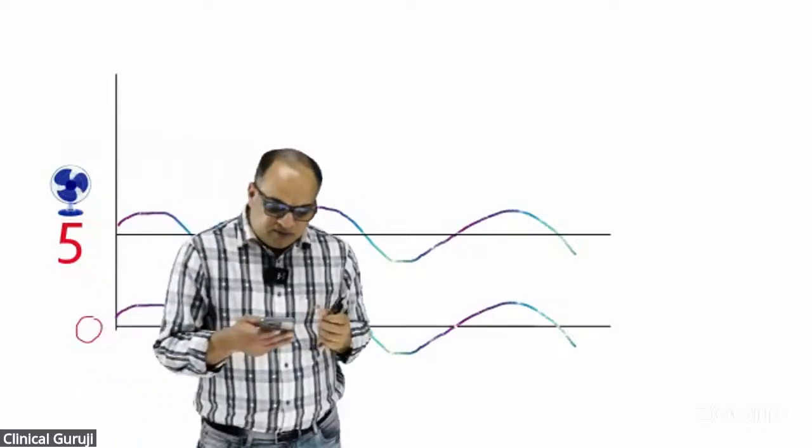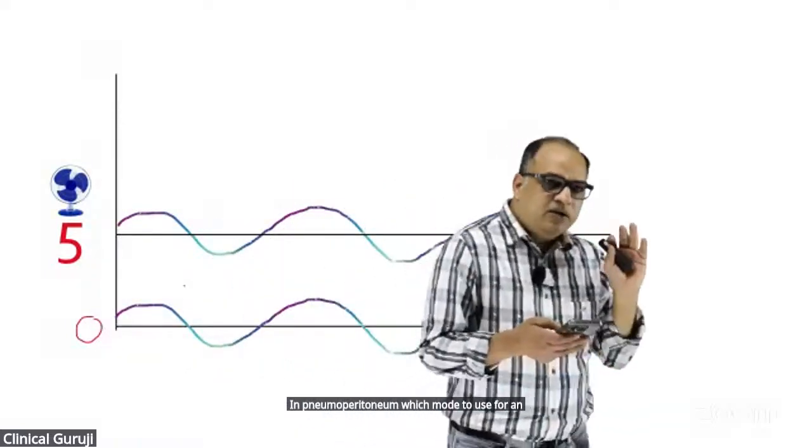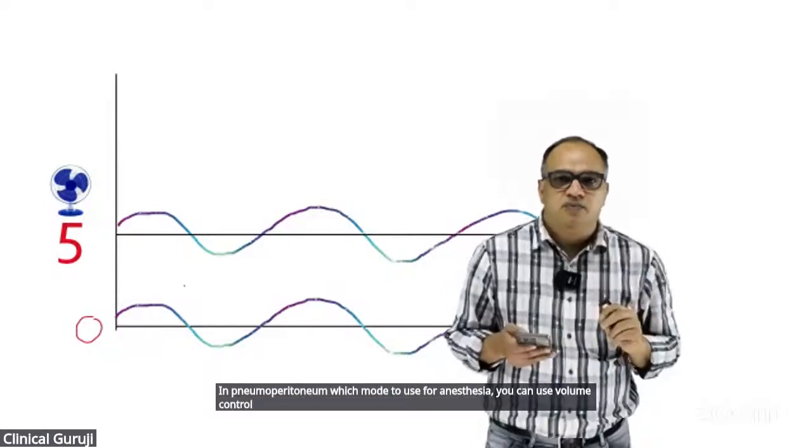In pneumoperitoneum, which mode to use for anesthesia? You can use volume control with low tidal volumes.